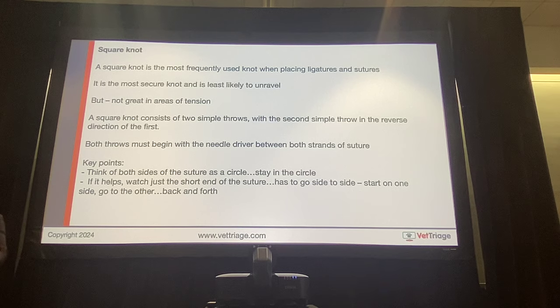For those of you who have never handled these instruments before, most of us will hold the needle holders with the thumb and ring finger. Some folks do palm it, and you can keep a ring finger in there and then palm it to open and close it. That technique is more helpful if you have a larger instrument. These are kind of tiny, so I would recommend everybody put a thumb and ring finger, and that's how you're going to hold these.